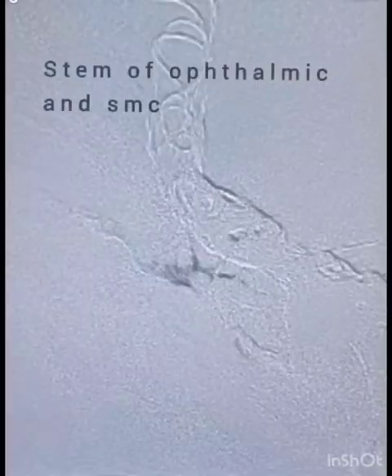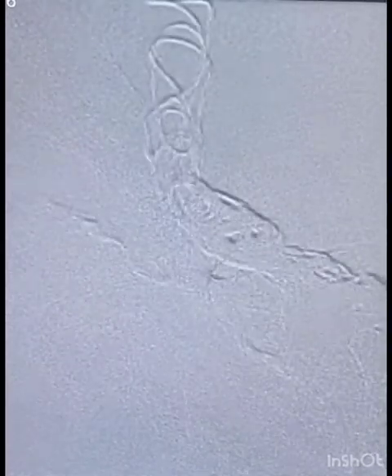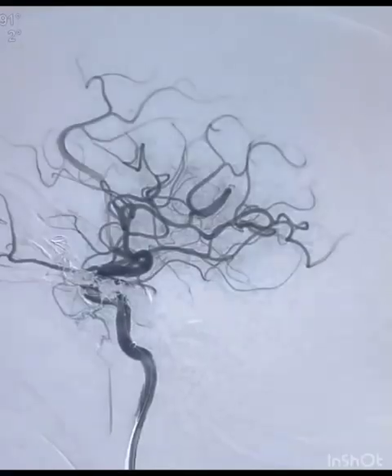Note spread of Onyx into the contralateral side through the intercavernous connections. With further injection, you note that there is further spread into the intercavernous sinus into the contralateral segment. Following that, you notice Onyx spread anteriorly into both the foot of the superficial middle cerebral vein as well as the ophthalmic veins.